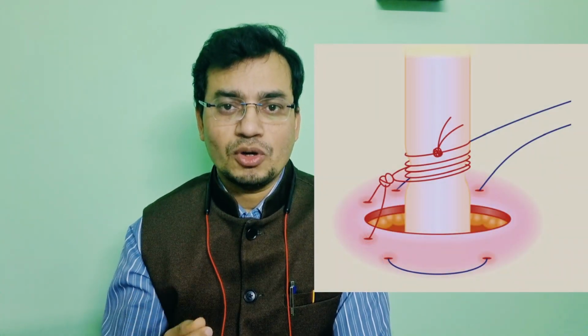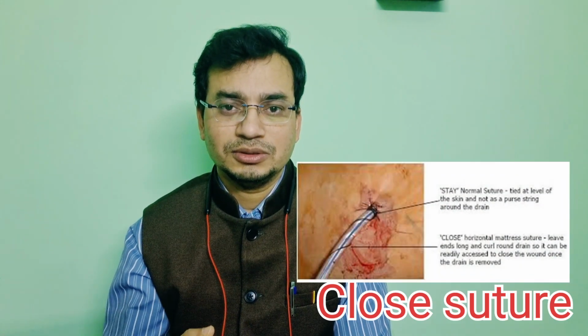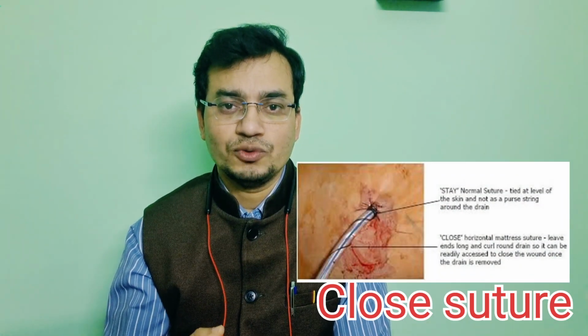So after you have placed an ICD successfully, you need to secure it, right? Two types of sutures are generally placed. One, the suture of chest tube is placed with a large silk suture, number 1 or number 0. Go around the chest tube several times, clinch down to create a small waist on the chest tube, and this is called the stay suture. The second suture, which is called the close suture, should be used to close the incision.